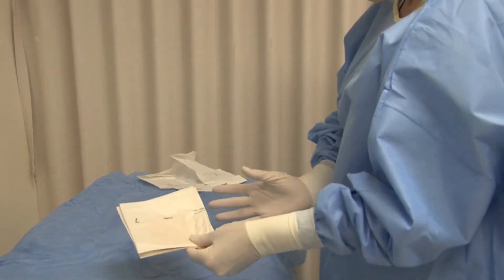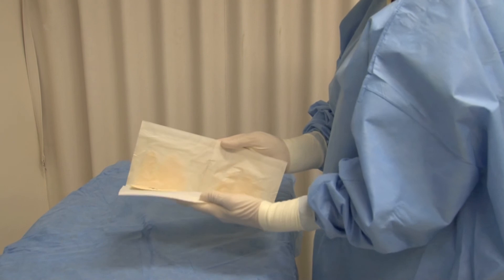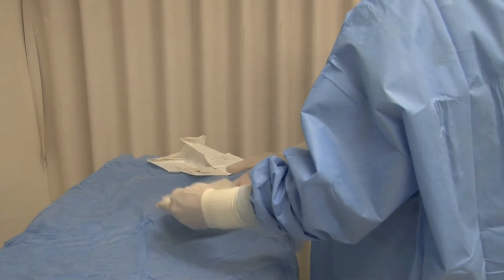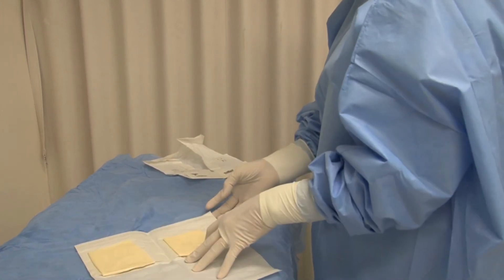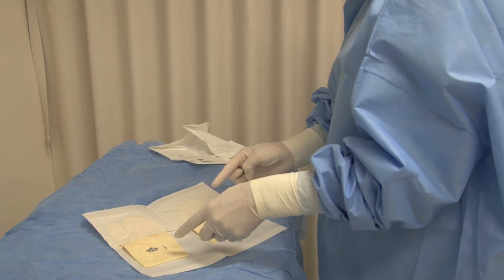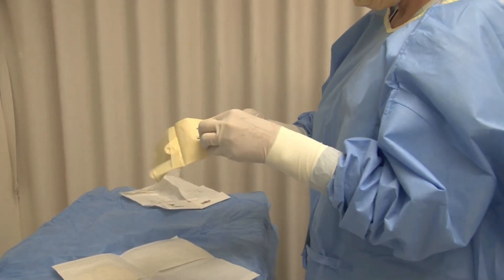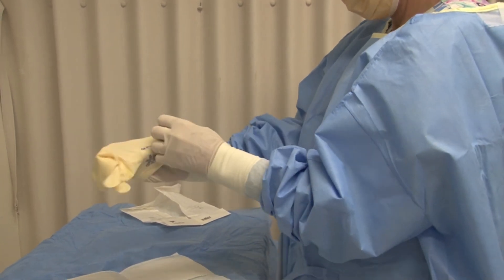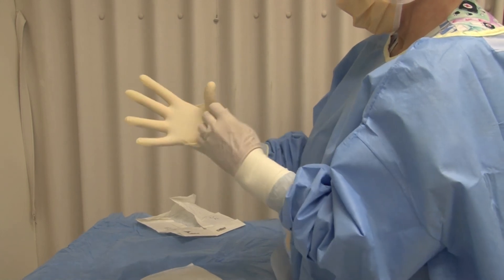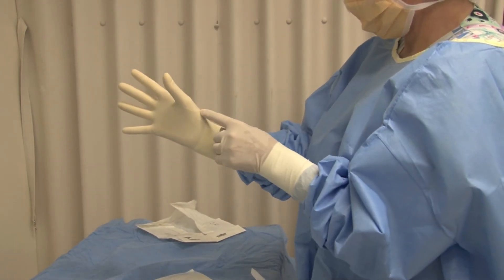We've got our first glove on — pop that out of the way. Now I've got the other packet. It tells me it's a size 7. I open the packaging, and as soon as I open it I can see I have a left and a right. I'll open it as I would normally on the trolley. Sometimes when you open it you can't see the left and right, so if you just go like that, the left and right flip up for us. I'll do the right one — pull it out, make sure you're away from your trolley, pop your fingers in, and you can see my fingers haven't gone into the glove. Pull the end, pop it in — my thumb did go in that time.